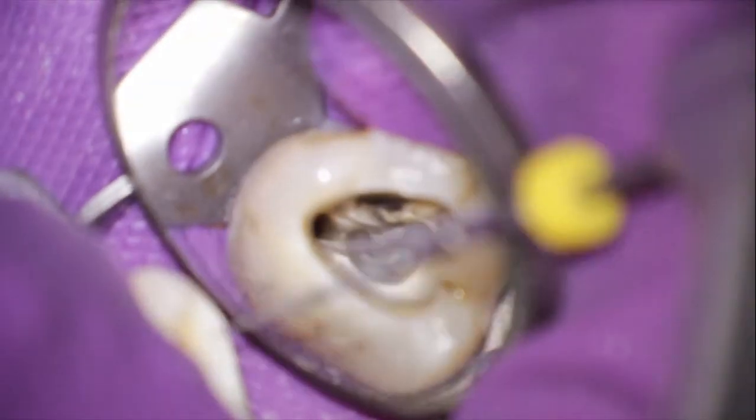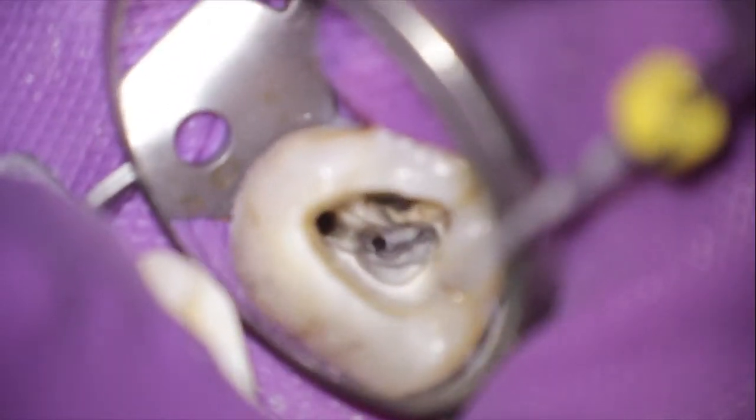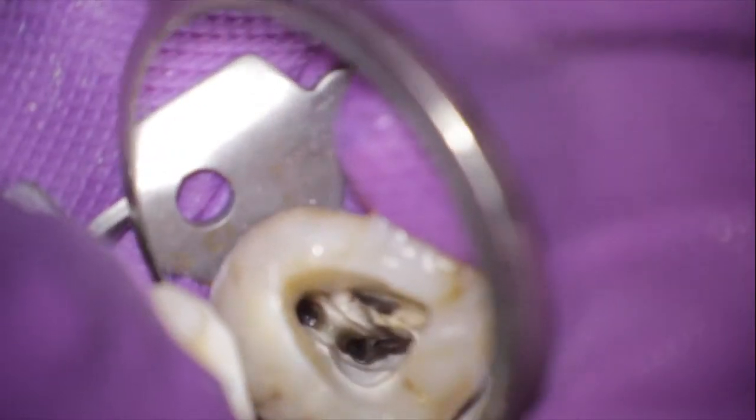The canals were treated so far with hand files and rotary files, and I just wanted to have a last finish of both canals with a file in reciprocation movement. In the buccal canal all was good and okay, but watch what happened when I put the rotating file into the palatal canal. It broke. It is always a bad feeling when you see the file comes out shorter than it should be.